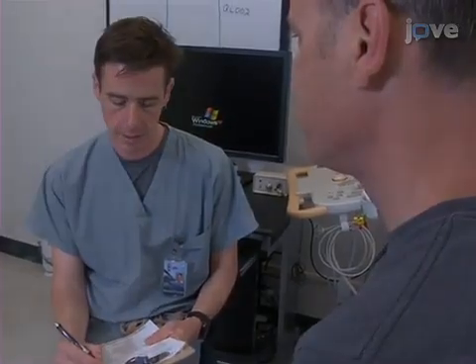When ready to begin, confirm that participants have fasted and avoided exercise for eight hours before the exam. In addition, make sure that they have avoided caffeine or nicotine for at least four hours, and avoided medications affecting vascular tone.